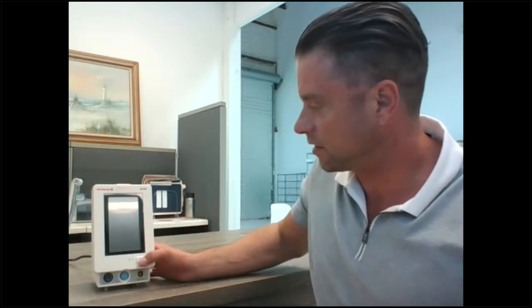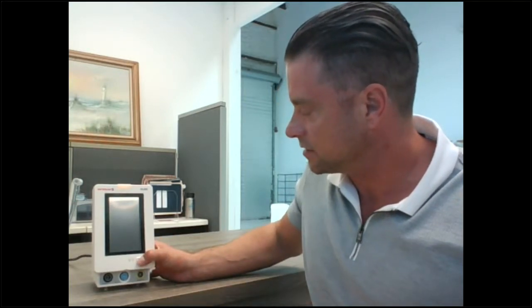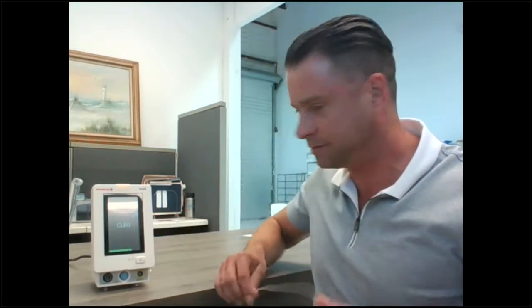To begin measuring CO2 or any of the parameters you wish to, simply turn the monitor on, and once it loads up, we can get started. I'll show you how to measure CO2.